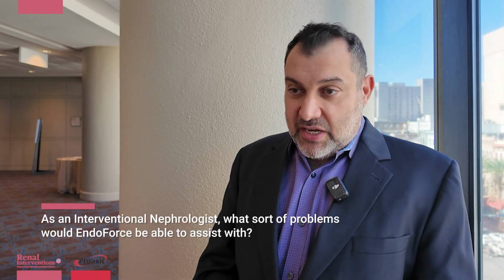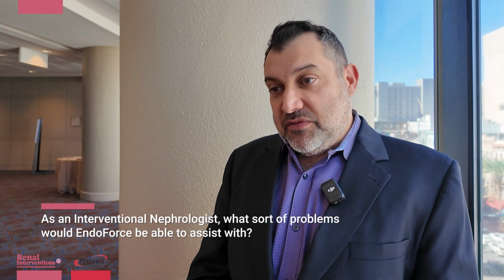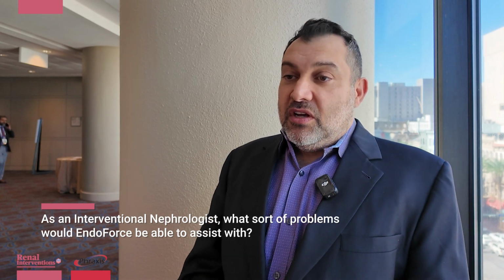So in the world of ESRD and vascular access, we have a difficult situation. We only have three options for folks to get dialysis. Those are catheters, grafts, and fistulas, and each of those comes with a problem. Catheters, of course, have a high infection rate. Fistulas, many of them don't mature, and it takes a long time to mature in the cases where they do, up to 50% in the US.